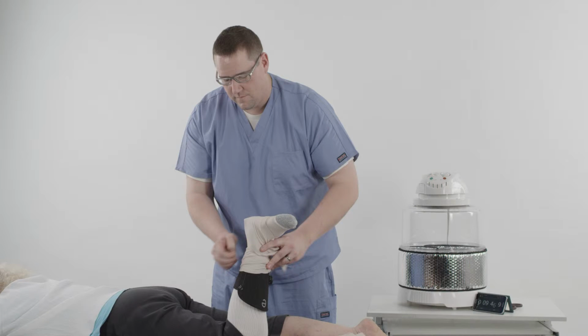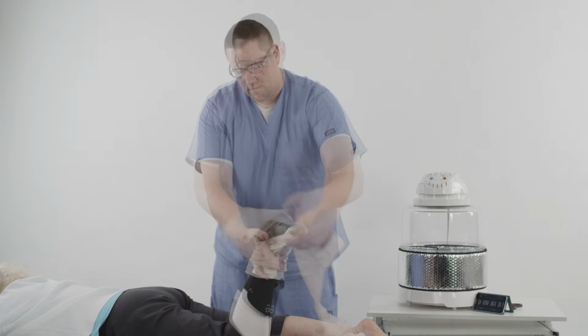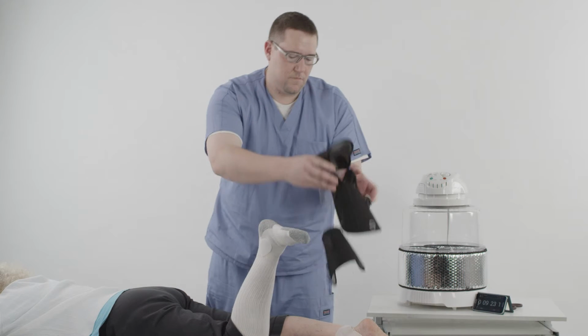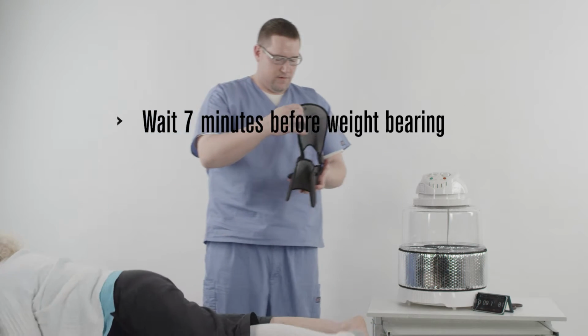The brace should be hard enough to remove and maintain its shape after 5 minutes. Once you're confident the brace is rigid enough, remove the ace wraps and slide the brace off the patient. Allow the brace to sit for an additional 7 minutes before weight bearing.